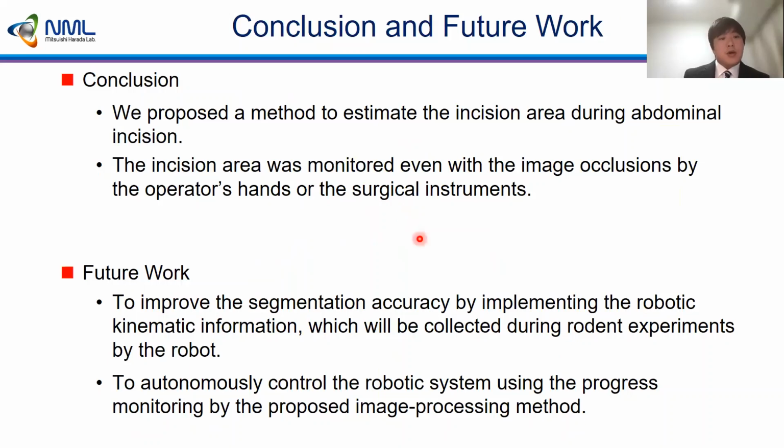To sum up, we propose a method to estimate the incision area during the abdominal incision task. The incision area was monitored even with the image occlusion by the operator's hands or surgical instruments.